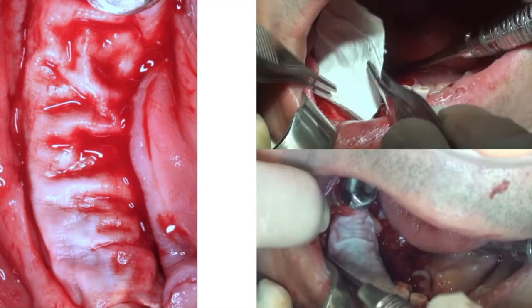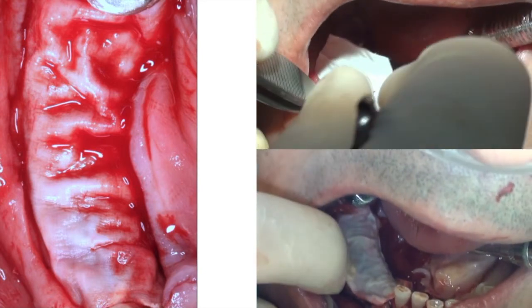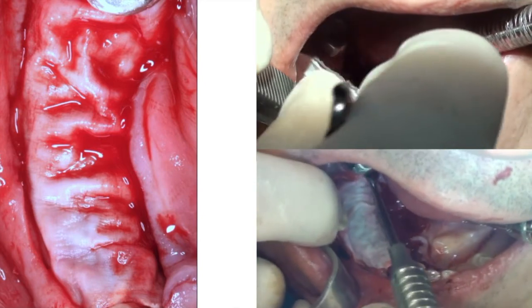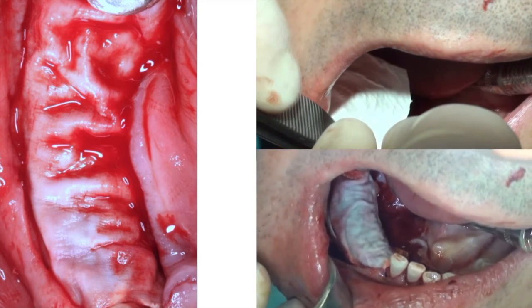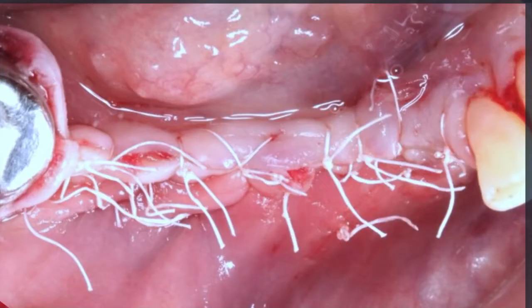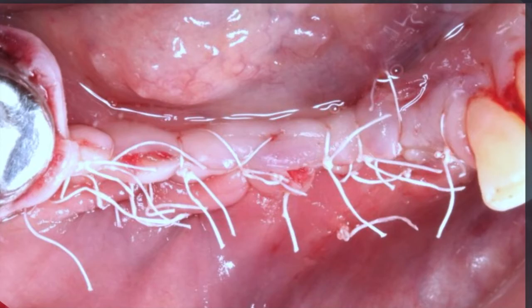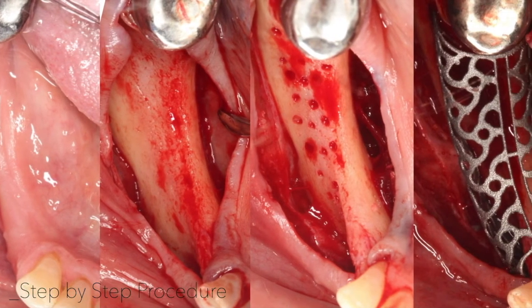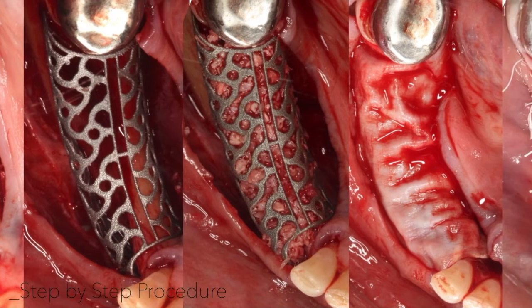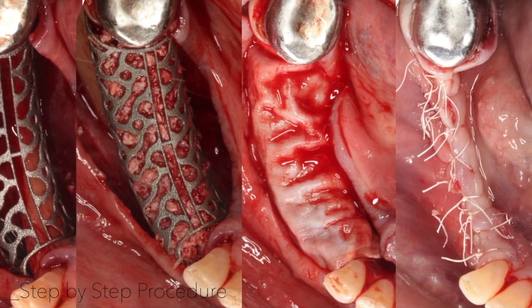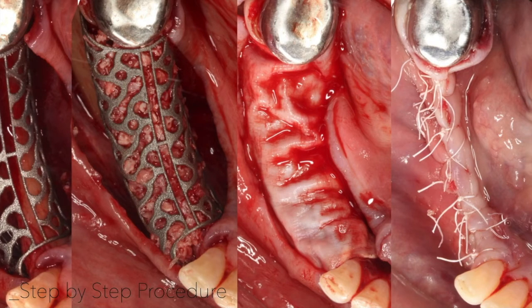We protect the regeneration with a BioGuide collagen membrane to prevent soft tissue invagination during the early healing phase. Finally, we close the flap with a double-line suture — a horizontal mattress suture with simple sutures over it. The full step-by-step procedure includes: full-thickness flap without releasing incisions, bone decortication, membrane placement with biomaterial, fixation, collagen barrier membrane, and suturing.